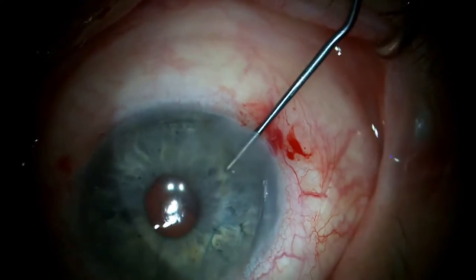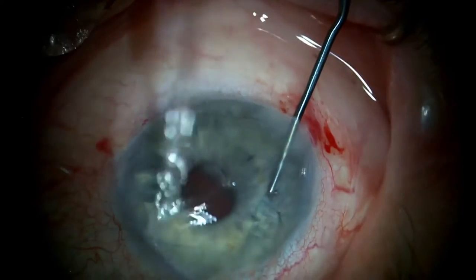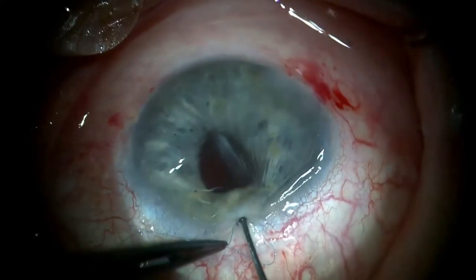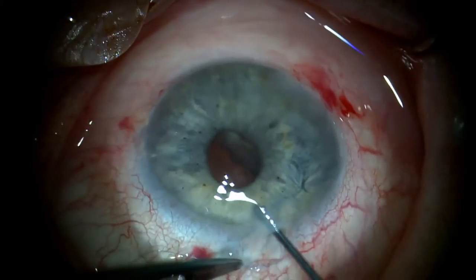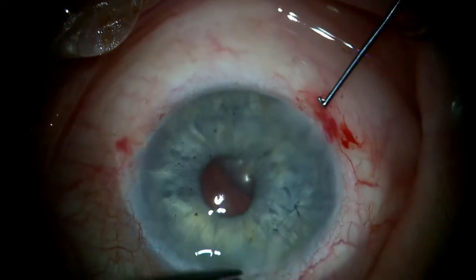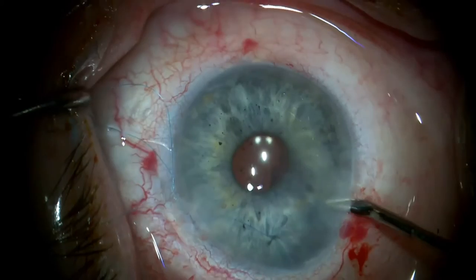The manipulator is repositioned to the other paracentesis to optimize tightening of the throw in this particular location. The third and final throw for the second haptic is taken inside the eye, with the final cinching of the throw again via the other paracentesis opening. The arms of the suture for the second haptic are cut in the same fashion.